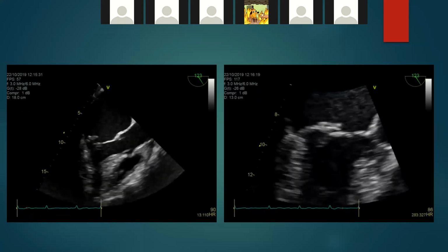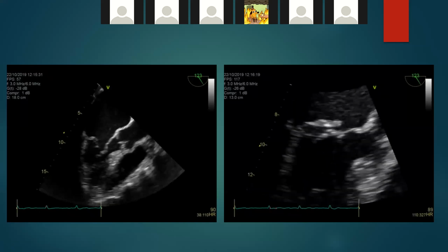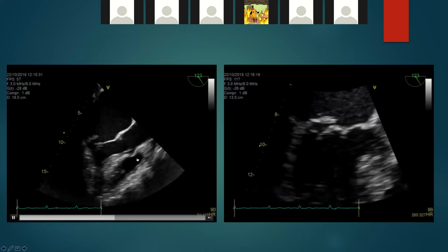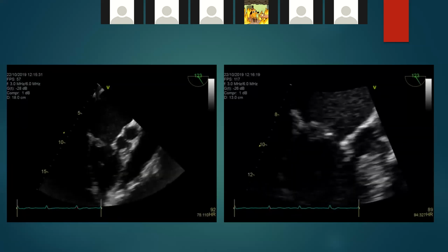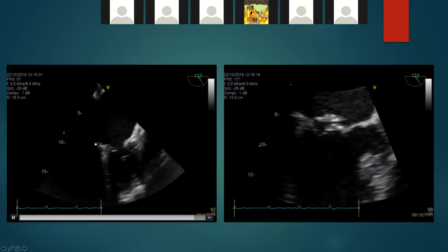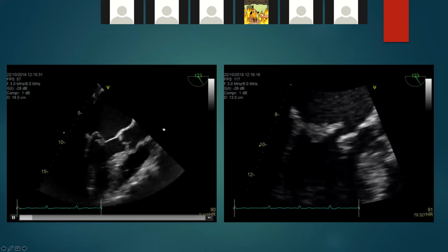It's a little bit of posterior, more of anterior. So only the 4-chamber is a bit weird to remember. Other views are pretty straightforward to remember. You can see it's almost your parasternal long axis of your transthoracic echo. And because you have this aortic valve, that's the anterior, the other side is the posterior. And it's the P2 scallop prolapse.